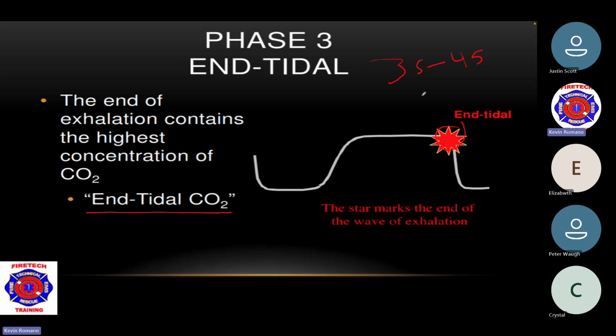So for your advanced EMTs and paramedics, this is a very good number to memorize if you don't already know it. You should know it. This is going to help with acid-base balance and how we're going to treat things.